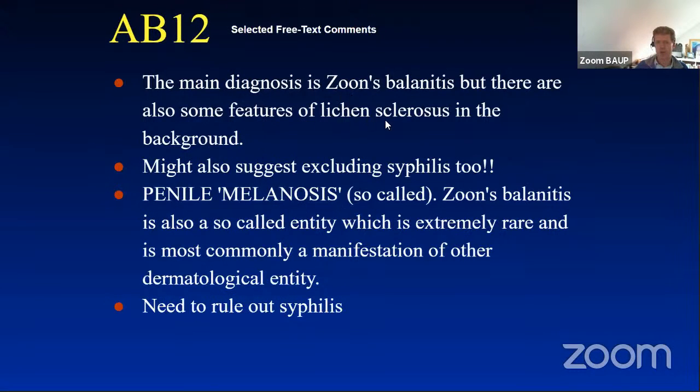So some people commented there's some lichen sclerosus in the background. Some people wanted syphilis, penile melanosis. Well, penile melanosis is melanin pigment, and it's not iron pigment. I need to rule out syphilis.